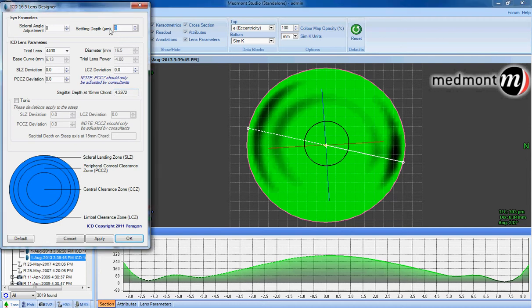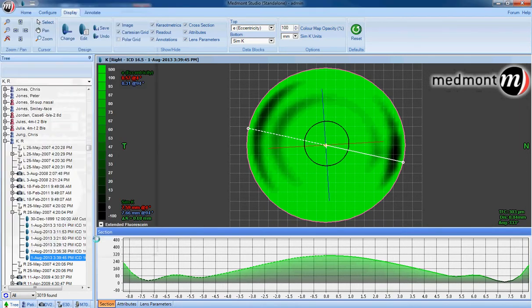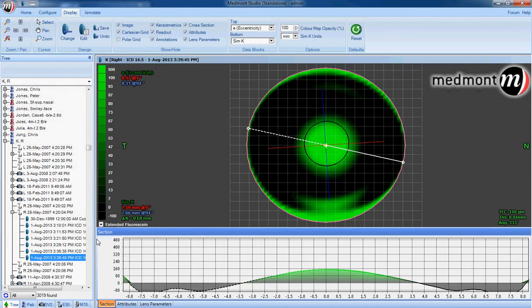A unique feature of the Medmont software is it allows us to enter a settling value to determine how the fit would change if the lens settled by the typical 150 microns or more or less.